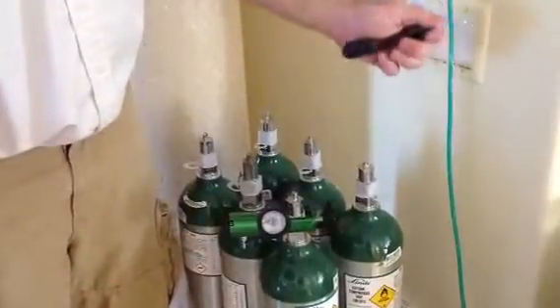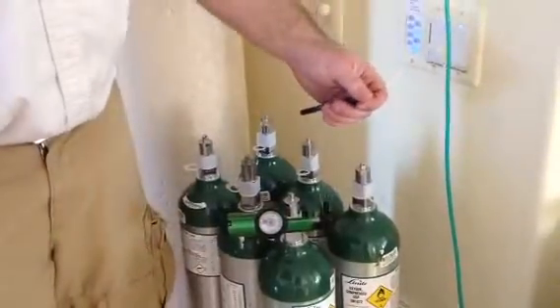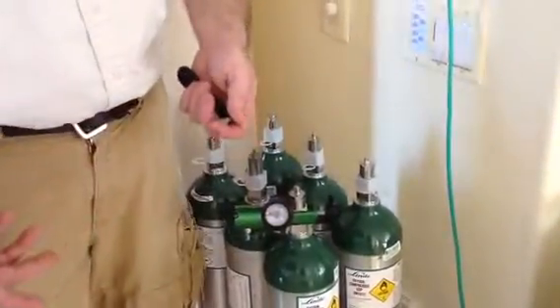If you close the cylinder, this gauge may read down to zero, meaning you have to have the cylinder on and open in order for this gauge to accurately tell you what's inside the cylinder.